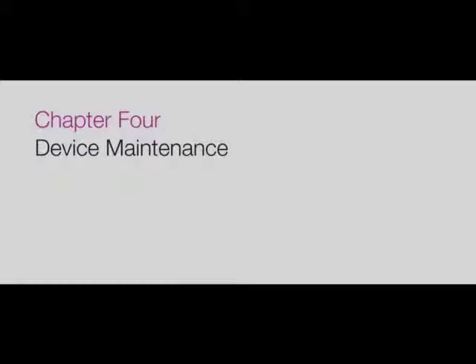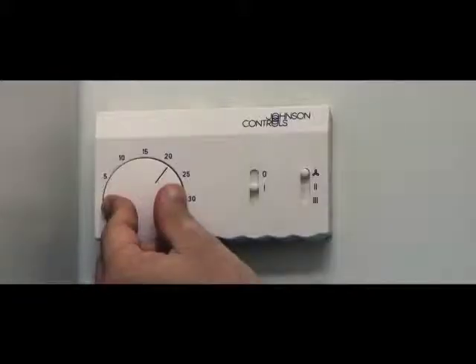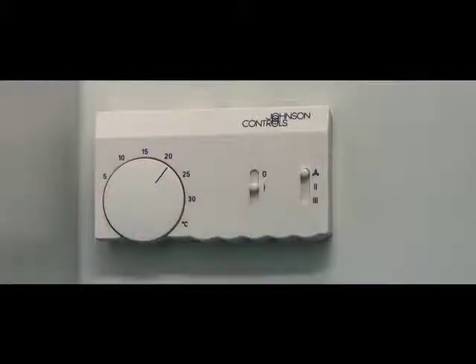Chapter 4. Device Maintenance. The device should be kept in a clean, well-ventilated, temperature-controlled environment. Make sure there is a minimum of 15 inches or 40 centimeters around the device for airflow.